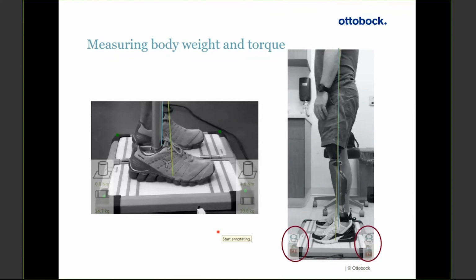It was a mechanical knee, and she was able to provide photos like this and evidence, real objective information to show that the patient wasn't loading their prosthesis. They organised a trial of a microprocessor knee, and he felt a lot safer, more comfortable. And then again, she was measuring him each time, and you could see the load had changed. He finally felt safe to put load through the prosthesis and trust it. And so she actually used this as part of her documentation, and I thought that was a really cool story. So that's the first thing, is measuring body weight.